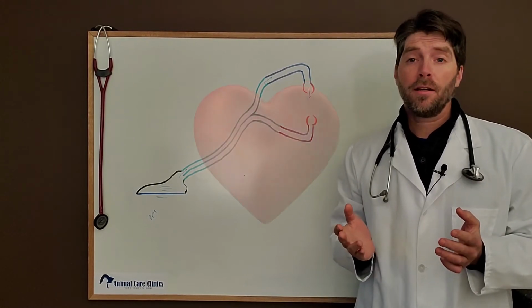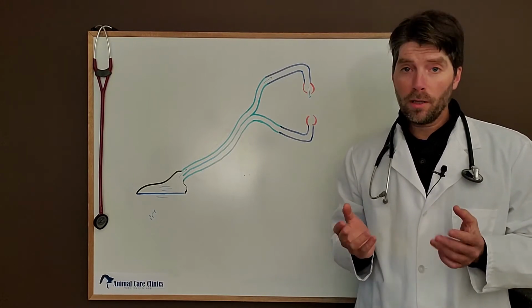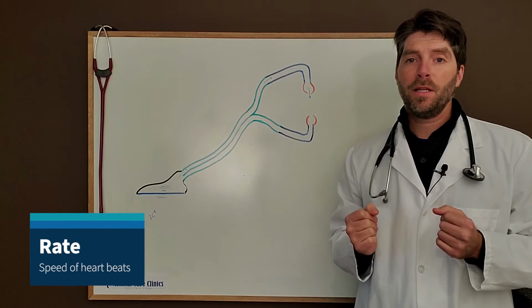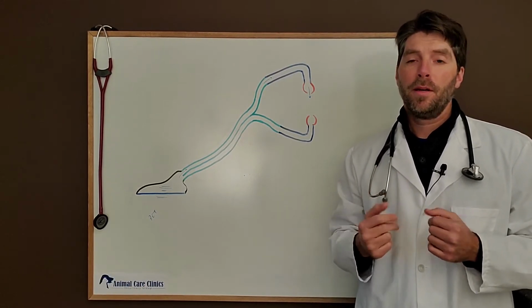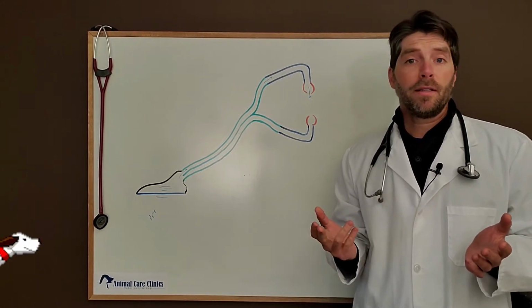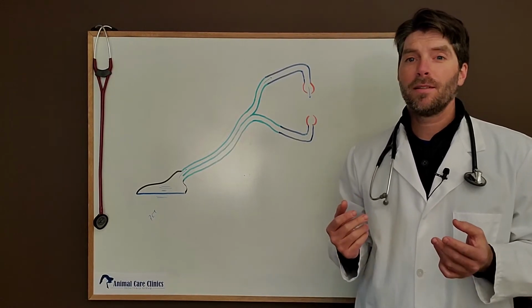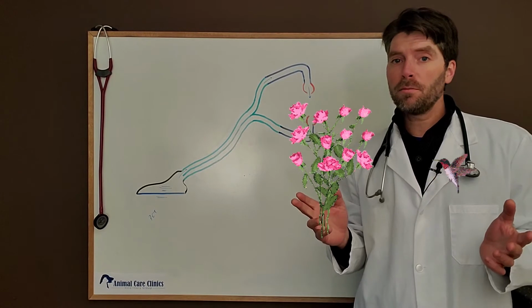With your pet's heart, we are listening to the rate, the rhythm, and the quality of the sound. So the rate is really simple. That's the speed or the heart rate. Thump, thump, thump, thump. That is the speed of the heartbeat. For an example, in something like dogs, it's about 100 beats a minute. Cats, about 120 beats a minute. Humans, you're looking at about 70 beats a minute. Hummingbirds, 1,000 beats a minute.